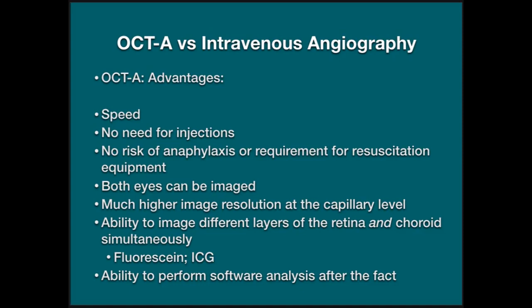The other advantage is that you can image both eyes. With traditional angiography, you really have to concentrate on one eye only, the eye of interest, because you really haven't got time to photograph both eyes with the one dye injection, because it's just not possible. You get a much higher image resolution with OCT angiography. You can get down to the very fine capillary level, something that you can't really achieve with dye-based angiography. And the other really important advantage is we can image different layers of the retina and the choroid simultaneously.